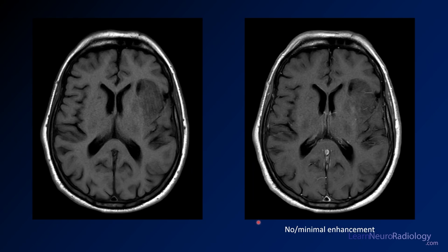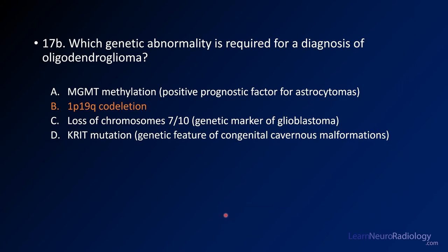On the pre- and post-contrast images, the lesion is a little ill-defined on T1, maybe a little cystic, and there's not much enhancement — perhaps a little hazy enhancement, but enhancement is not a predominant feature of this lesion. This is what an oligodendroglioma looks like.